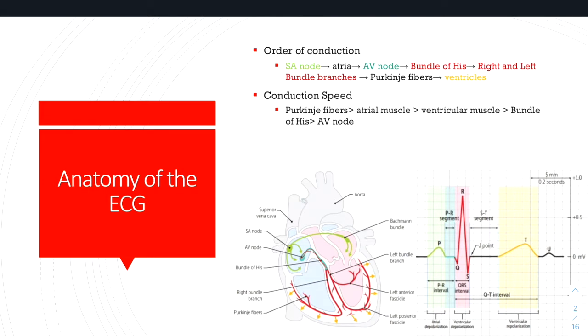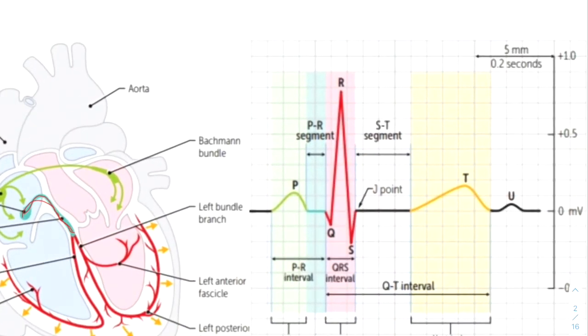As we know, the ECG is the marker of electrical activity in the heart, and those things are accompanied by mechanical activity as well. So you have here just an outline of the order of conduction of electrical impulses, starting at the SA node, passing down through the AV node, ultimately terminating at the ventricles. And then this is essentially an aspect of your ECG tracing.